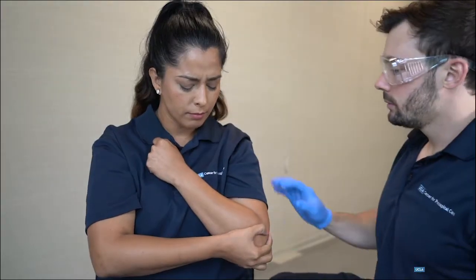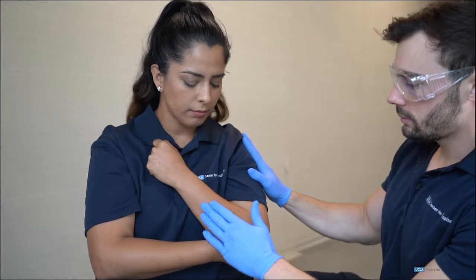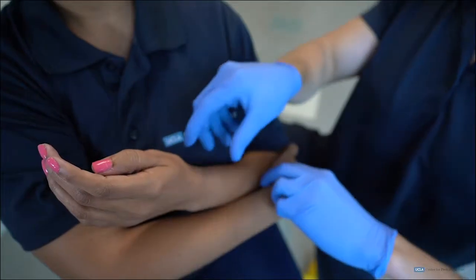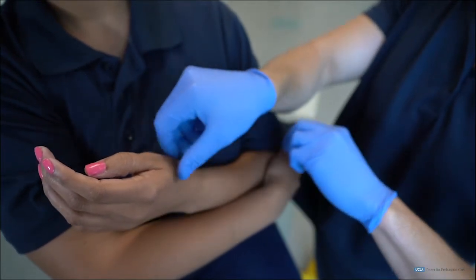The EMT will direct his or her partner to maintain manual stabilization of the injured extremity. The EMT then assesses for circulation, motor function, and sensation distal to the injury.